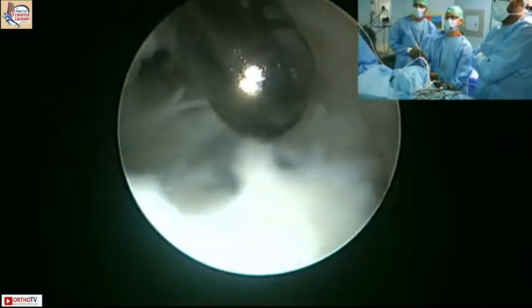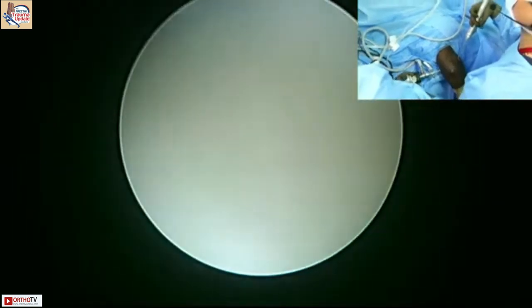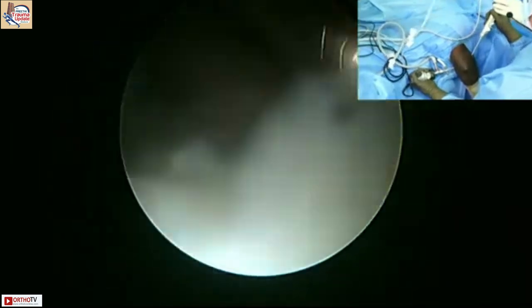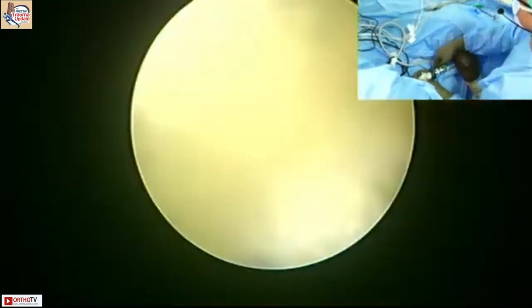Suction, please, on this. That's it, not too... Stop. Suction off. Okay. So there is nothing now. It's removed. Now, if you want, I can do a little bit of burring, and then that's it for the anterior side. I can take that coronoid piece.